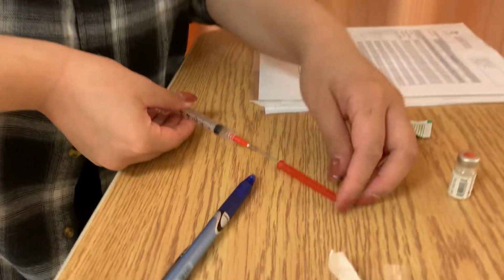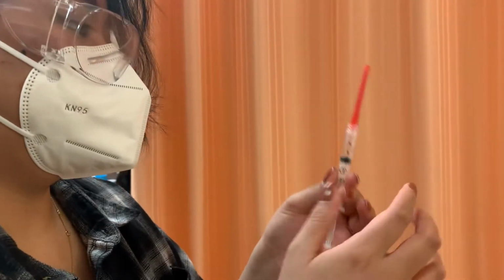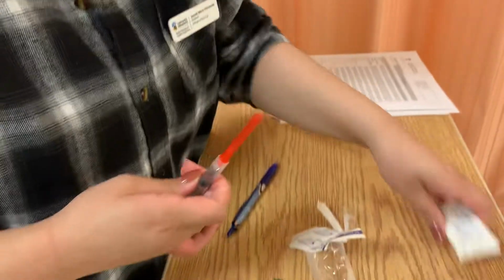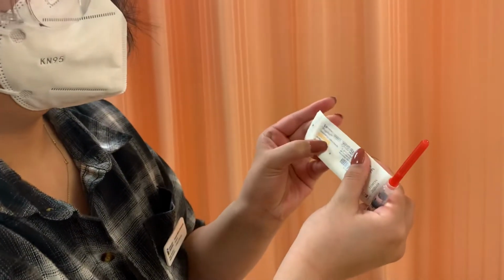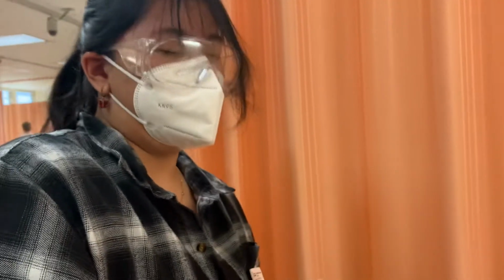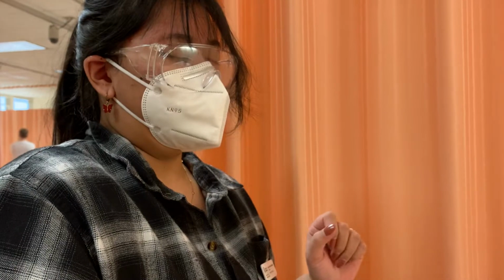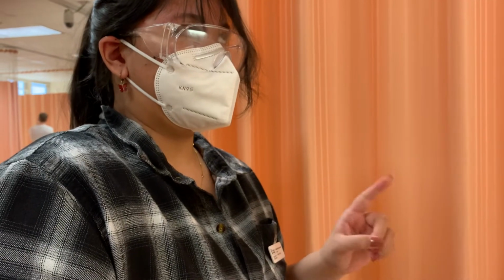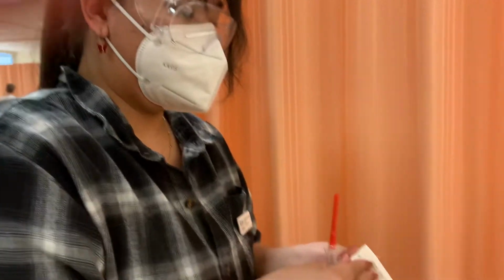Just going to push it in against the table. Okay. Now I got that. I've got to pull back the plunger to make sure there's nothing left in the needle. So this needle is a 25 gauge and 5/8 inch needle, which is perfect because the range for subcutaneous is 25 to 31 gauge and half to 5/8 inch needle.